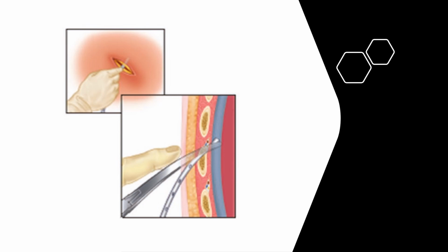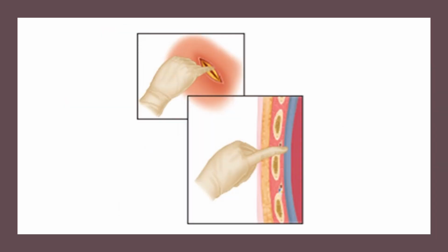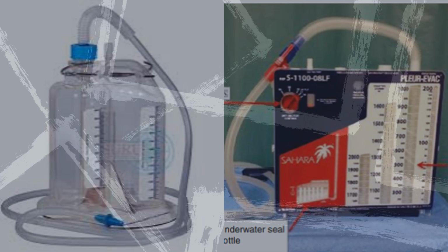13. Once the tube is in the desired position, connect the tube to the drainage device. Once connected, release the cross clamp on the distal end of the tube. 14. Secure the tube to the skin with 0 or 1/0 silk or nylon suture. I would suggest speaking to your senior in the emergency or surgical departments, as each has their own preferences on how they want the tube secured.